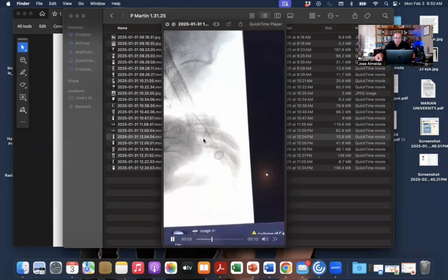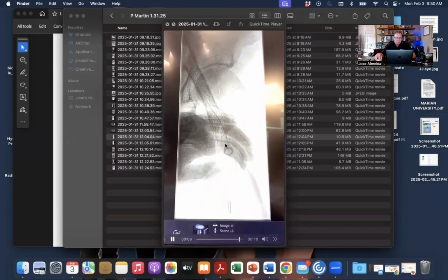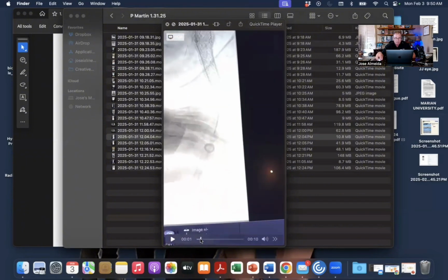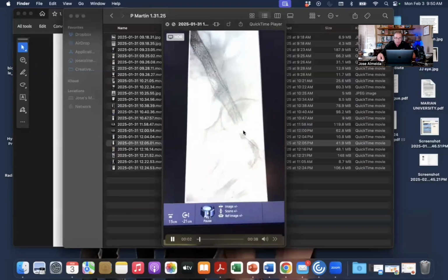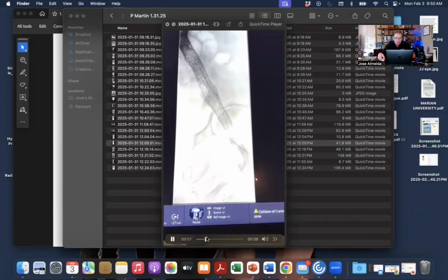So back to the left side, which again is occluded. Here's our catheter from below. And what I'm showing you here is direct puncture of the distal stent with a needle under fluoro, and how I just navigate the needle under fluoro, rotating my hands at the same time. And here I got a cross wire into the stent and navigating the wire north.